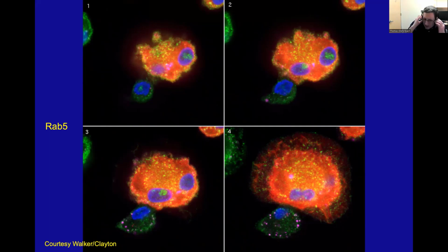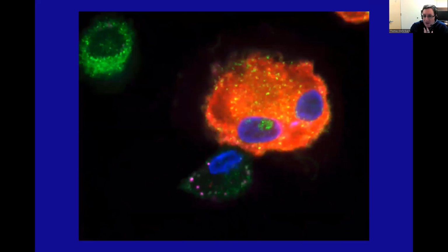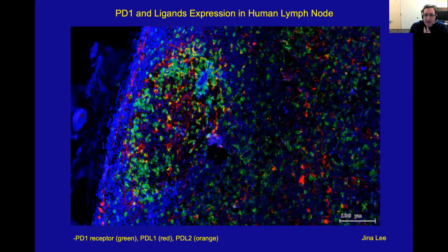But yeah, the nice thing too is that the StrataQuest software and even TissueQuest can quantify the puncta, or the points, these spots within the cell. So you can try to associate localization between HIV particles and the different endosomal markers. Just another close-up of that cell.